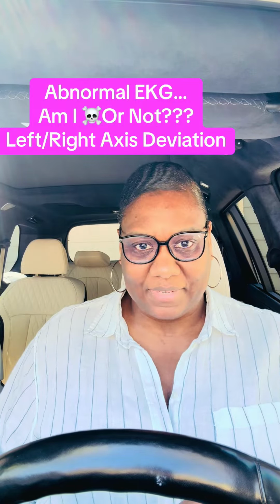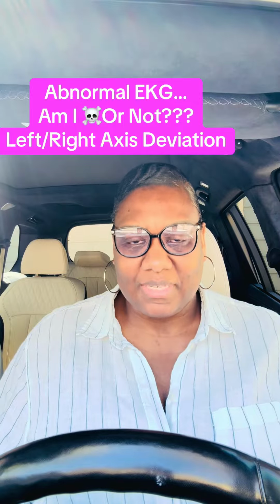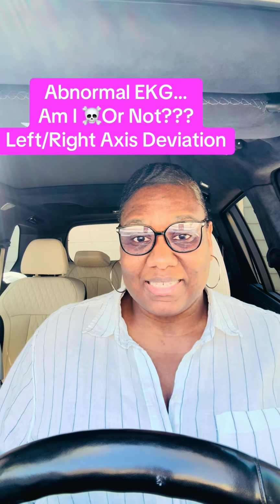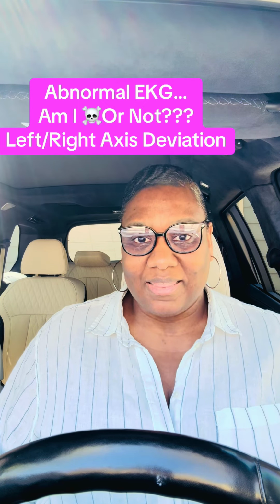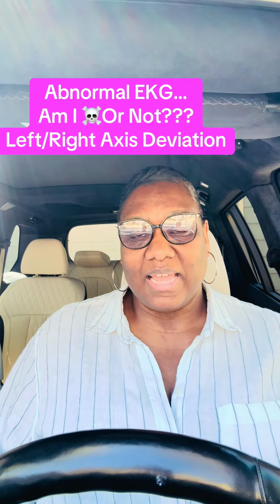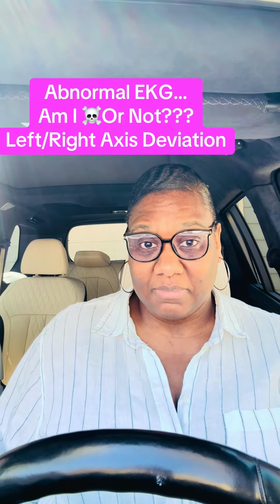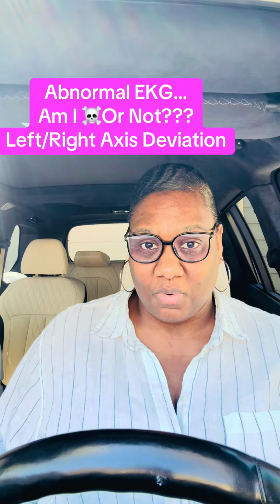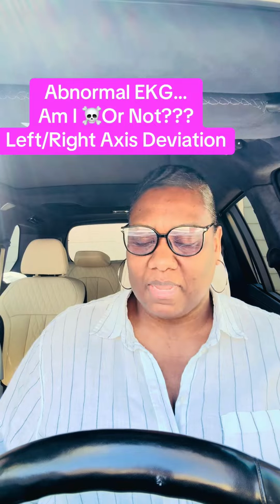Now let's look at the left side. Left axis, I'm getting excited. Calm down, Andrea. Left axis deviation, again, in the presence of symptoms, because context matters. Left axis deviation with symptoms could mean that there is a concern for impaired coronary blood flow. Could mean.